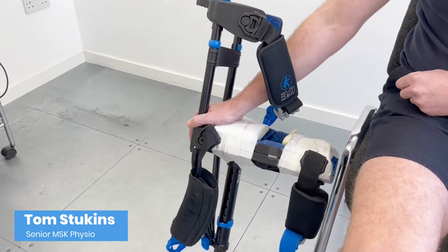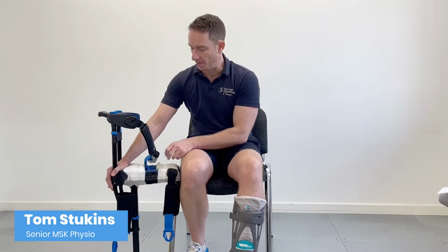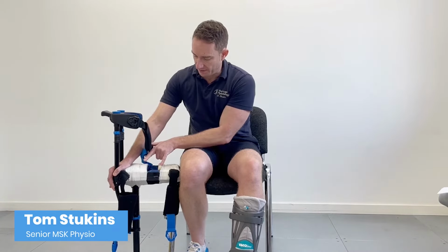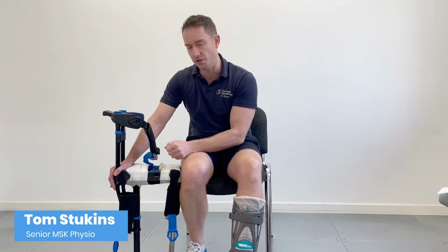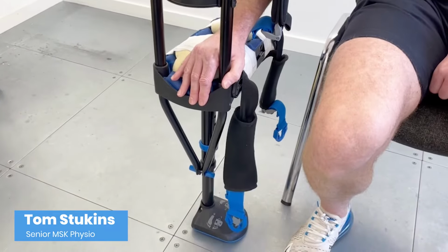As you can see, with a little bit of imagination and with a little bit of upholstery cushioning, you can create a workaround, which means that the valve now sits in the void between the two padding, meaning that once again you get used to the pressure distribution, you can build up your tolerance and have quite a lot of stamina in order to give you your freedom back once again.